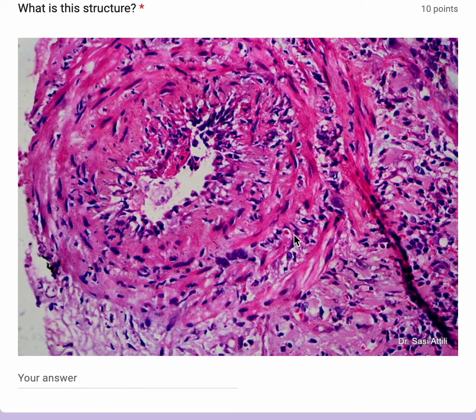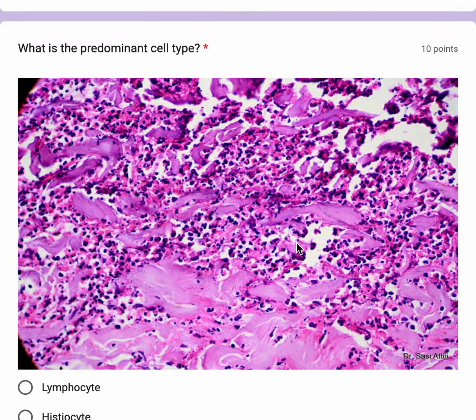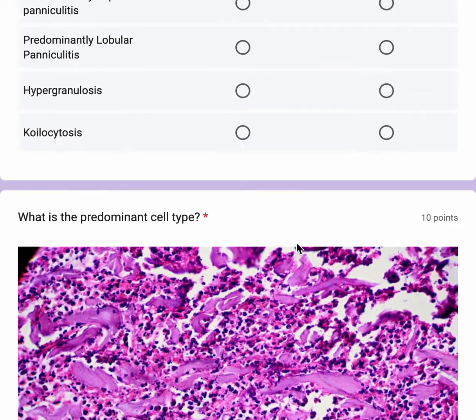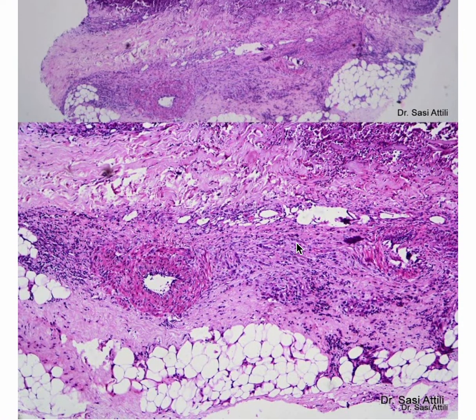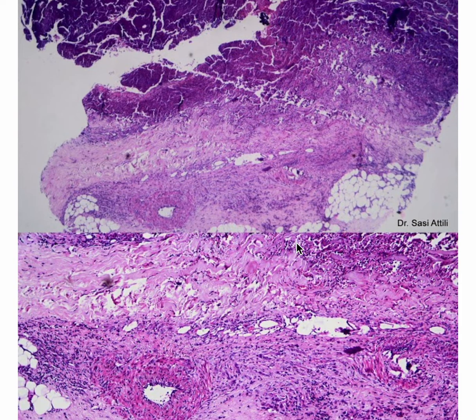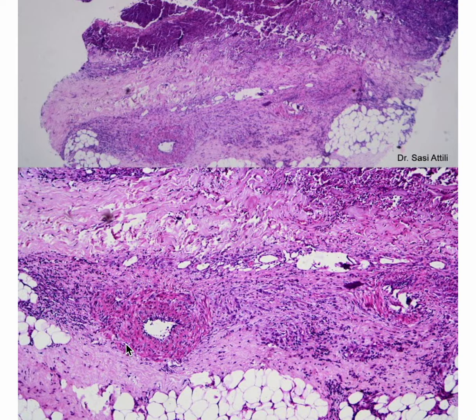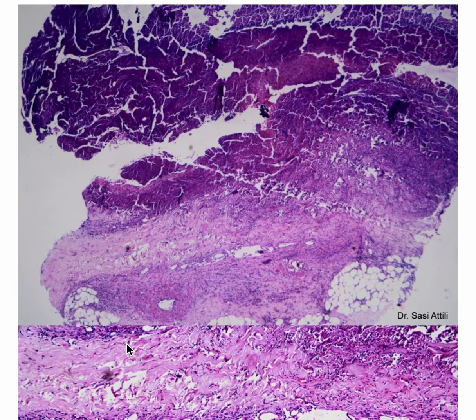All right. So this is not leukocytoclastic vasculitis. We use the term leukocytoclastic vasculitis when it is just a small vessel vasculitis. This is a medium vessel vasculitis. It's not a small vessel vasculitis, and because the medium vessel is involved, there is quite severe vascular compromise leading to necrosis of the epidermis. The epidermis is completely necrosed or ulcerated. If it's a small vessel vasculitis, you won't find this amount of necrosis or ulceration on the surface.